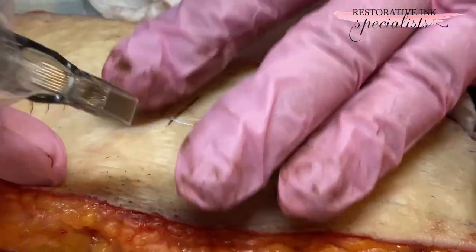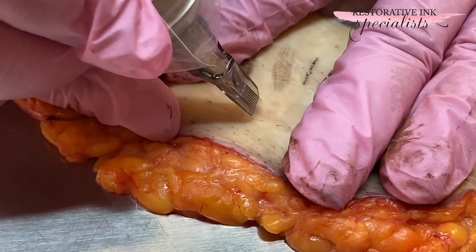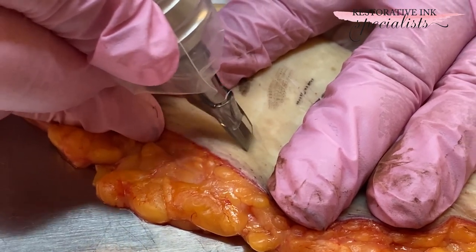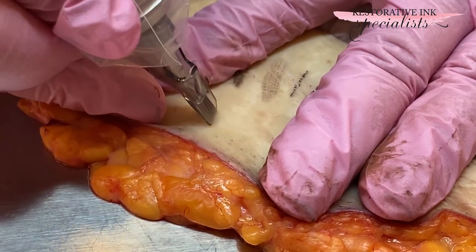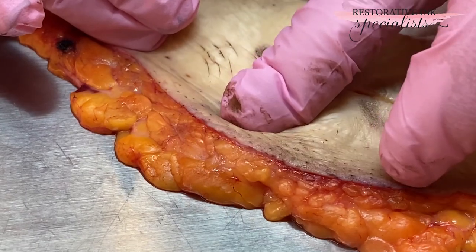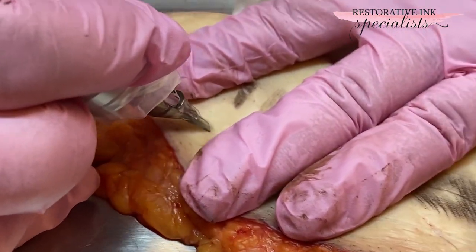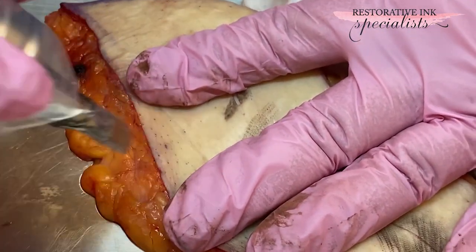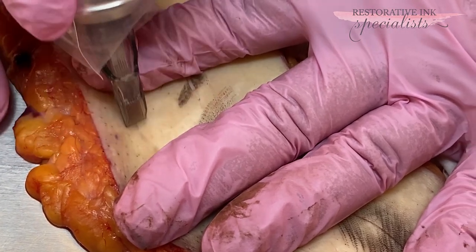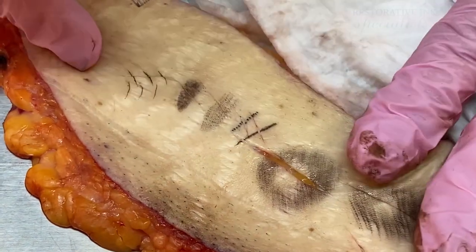If I just pick a spot here — right there — I just needle it. There's no blood supply obviously, because this is just a piece of skin. Normally I would get a little bit of bleeding that looks like petechiae. Hard to demonstrate on a piece of skin, but it does feel smoother. When we needle, we can go across the scar in a circular pattern, and we can also go along the scar in a back and forth pendulum type of pattern. As you feel that scar, you can feel the scar bundle relax. And that's it for today.